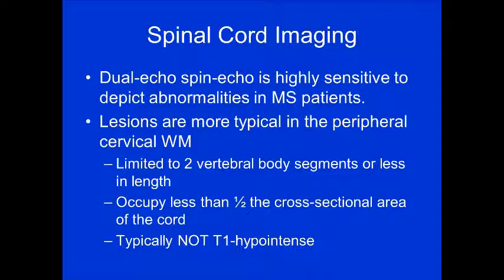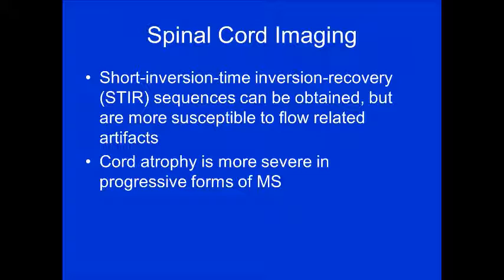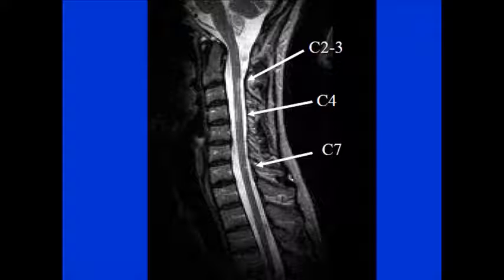If you look at the brain and see nothing but the ordering physician still suspects MS, look at the spinal cord. Typically you use dual echo or spin echo, which is highly sensitive. Lesions are more typical in the peripheral cervical white matter, limited to two vertebral body lengths or less, and tend to occupy less than half the cross-sectional area of the cord. Unlike black holes in the brain, spinal cord lesions are typically not T1 hypointense. STIR can also be used, though flow-related artifacts can limit evaluation. Cord atrophy suggests a more progressive form of MS.